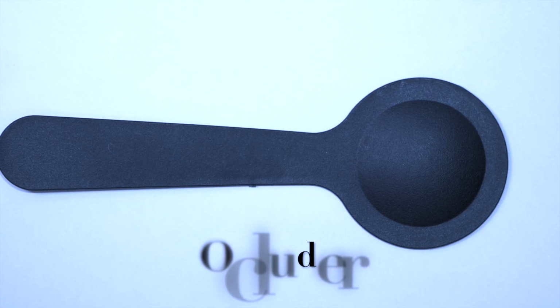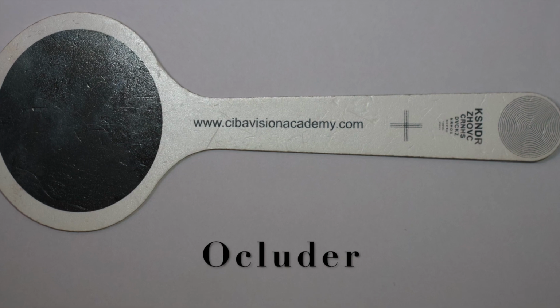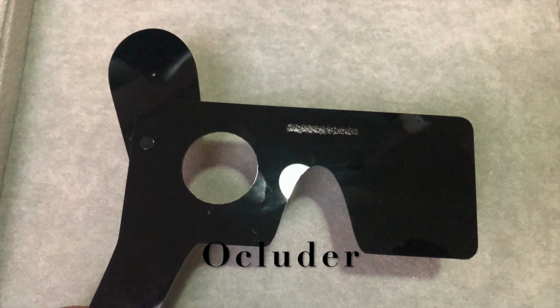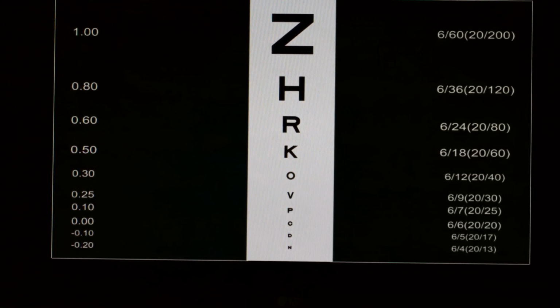It is best to use an occluder to cover the eye, and as you can see here, you have a lot of choices on which ones to use for the eye. All of them will work just as well. When ready, ask the patient to read from the largest to the smallest letters that they can. You can glance back and forth from the chart to your patient to monitor their progress and check if they are still covering one eye.